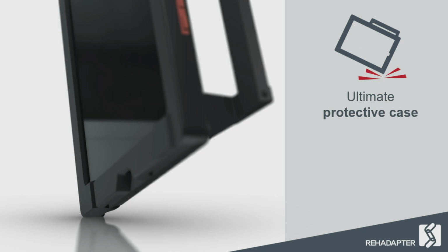The Rehadapter is a protective case that has been designed for extensive daily use. It has not only a sturdy design, but is also made out of reinforced plastic, delivering the best possible protection for the iPad when it's installed. The iPad itself is surrounded by rubber bumpers that also absorb shocks from outside influences once the iPad would fall down, for example.